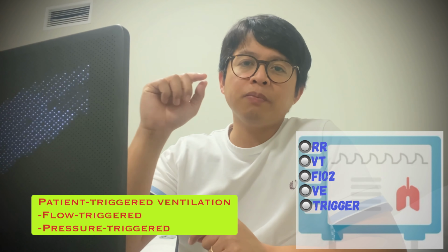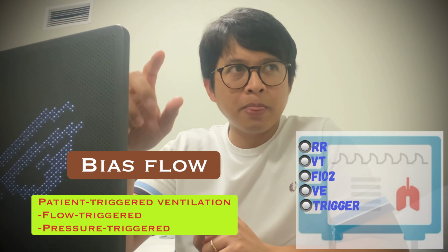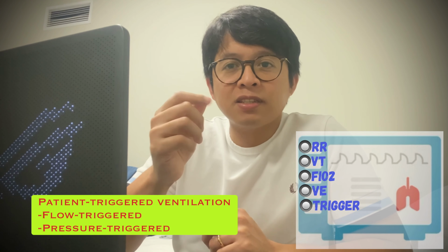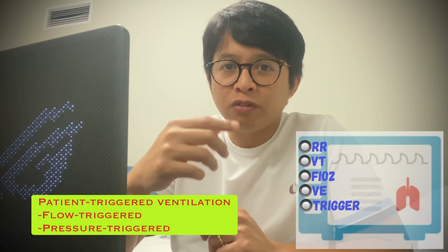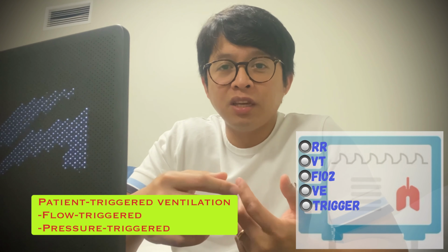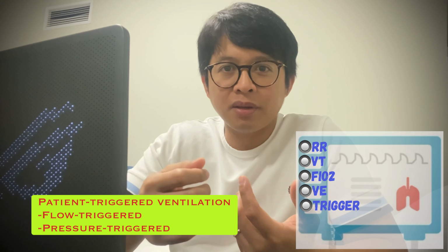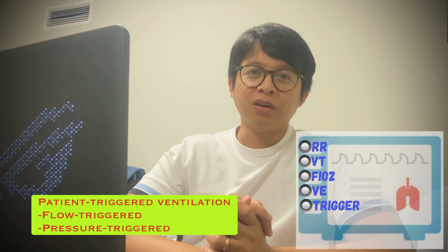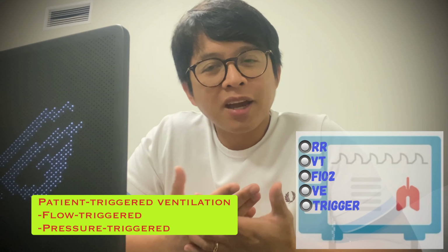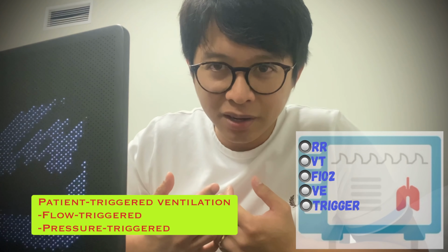Okay, what is bias flow? Bias flow is a gas constantly circulating in the ventilator circuit. Let's say 5 liters per minute of bias flow is set. When patients draw some of these 5 liters in an attempt to inhale, the ventilator senses the deduction of the flow. This tells the vent that it's time to give a breath, and it will be instant. On the other hand, when the patient takes pressure from the circuit and the mechanical ventilator initiates a breath, that is pressure-trigger ventilation.